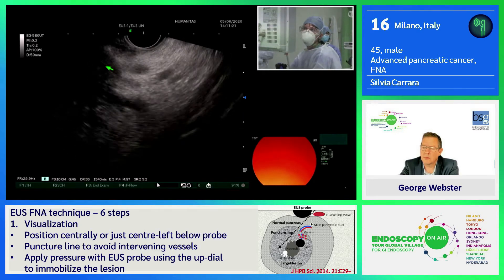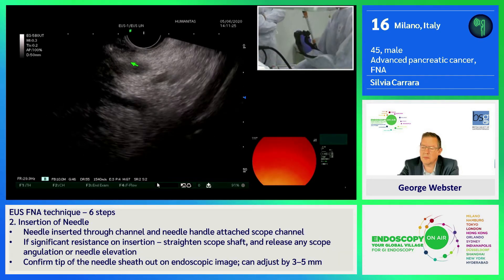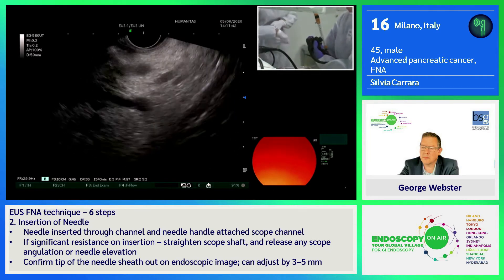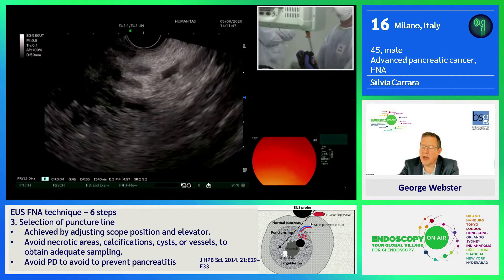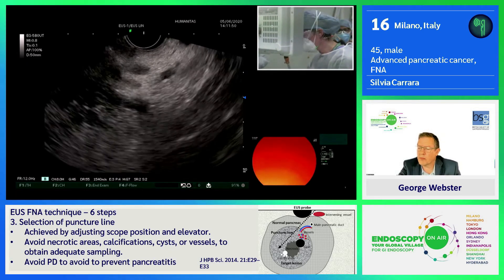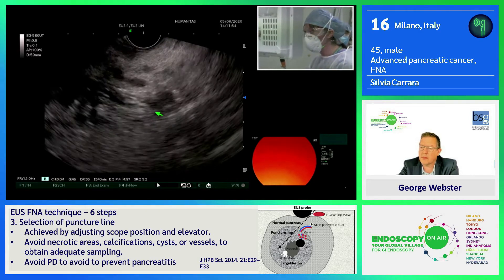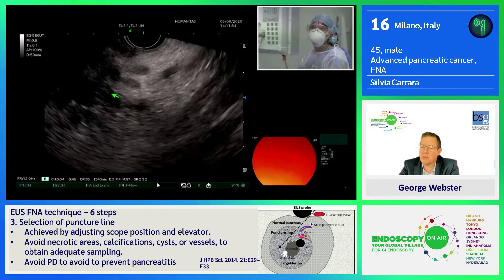The instrument is very flexible, even at the level of the tip. We can adjust the picture and use the harmonic compound. The picture is very good with the arrow, showing how we can visualize the infiltration, which is very important for vascular staging.